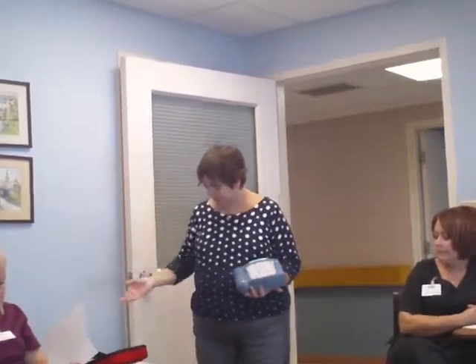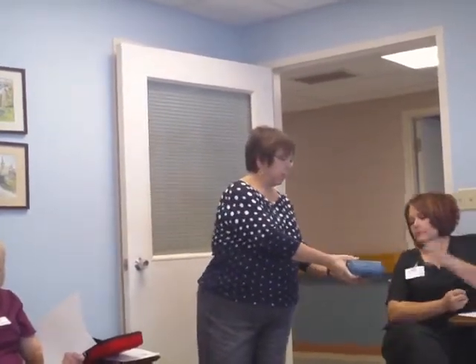There's a website I have to go to. You could wipe down the outside of this with a Clorox wipe, if we do have to use it in a room. Obviously, we try to keep it as clean as possible. You can use a wet cloth as well, but I checked with Cindy and she said we could use a Clorox wipe, so Cindy's giving me the blessing. Let me pass it around so you can see. It's really not very heavy. It's just going to look different, might sound a little different, and the location is different.